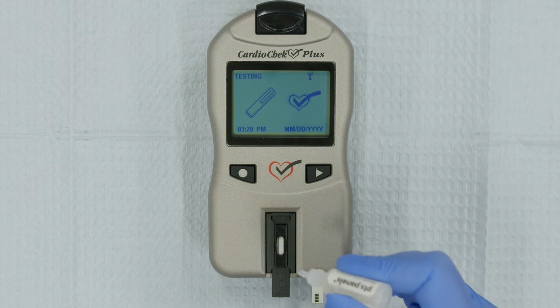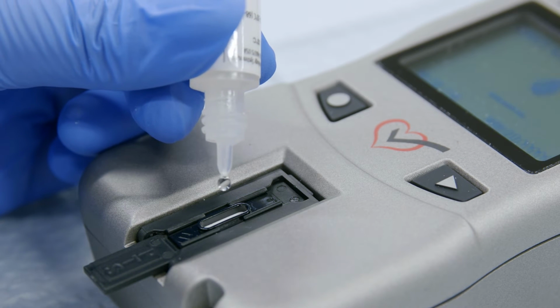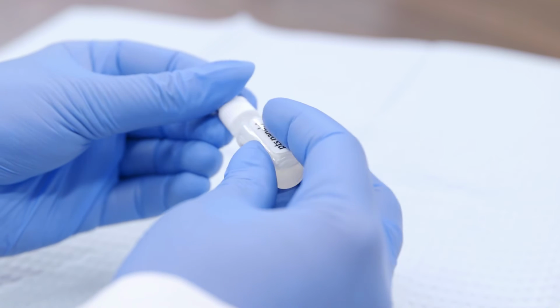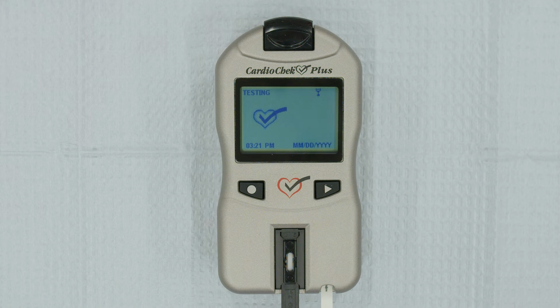Next, apply solution to the lipid panel test strip. Turn the level 1 control vial upside down and hover the tip directly above the test strip blood application window. Do not touch the test strip with the vial. Carefully squeeze the vial to deliver 2 drops of control solution to the blood application window. Replace the cap on the vial of control solution. The analyzer will automatically begin testing and will return results in as little as 90 seconds.